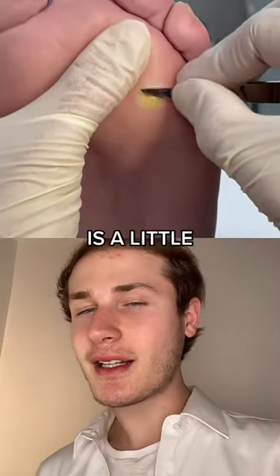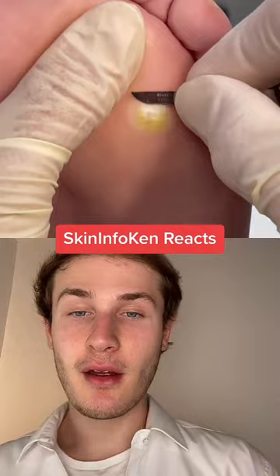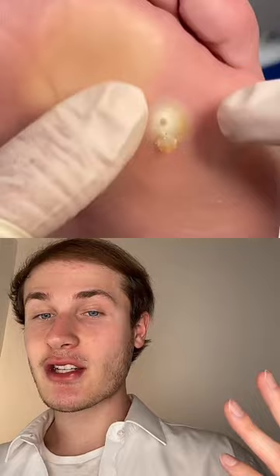This corn removal is a little different than the others because it's a surprise, let's watch it together. So what you're seeing right now is just a surgical blade shaving away at the thickened skin. Now anyone can actually develop a corn, but here it is — it has a fluid filled pocket.